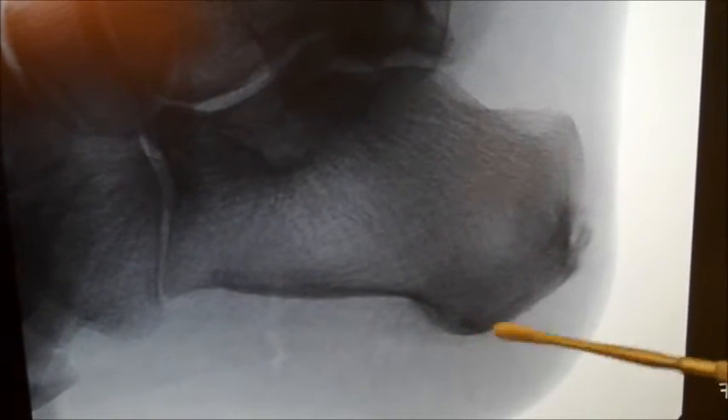You can see here now that the actual spur down from the bottom of the heel is now gone. Any little shadowing is just the bone paste, which will irrigate out in a second.